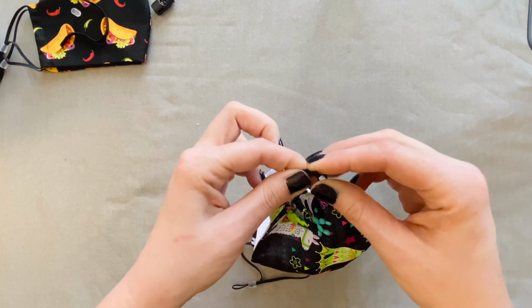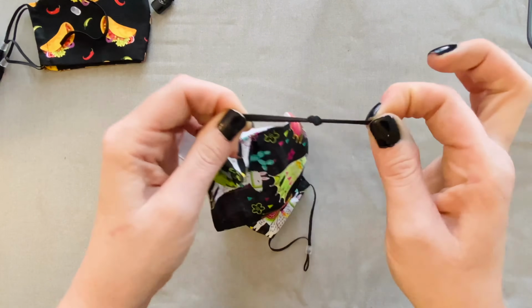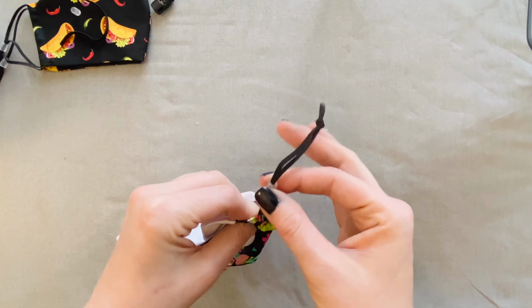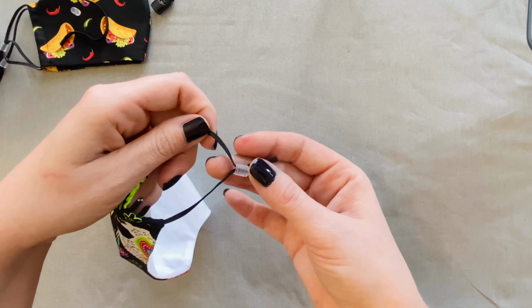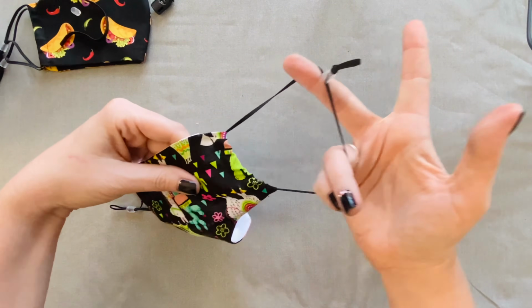I'm gonna do a little loop-de-loo, and I'm gonna tie a knot there, okay? And then I can go ahead and I can push all the way to the end, and it won't come off. And you've still got plenty of elastic for your child to be comfortable.